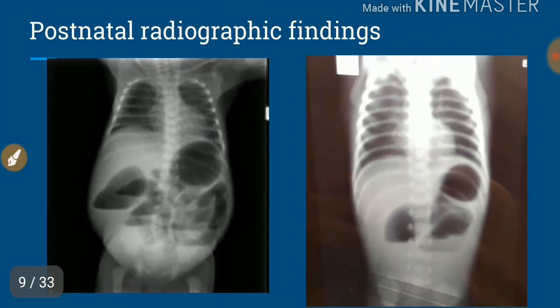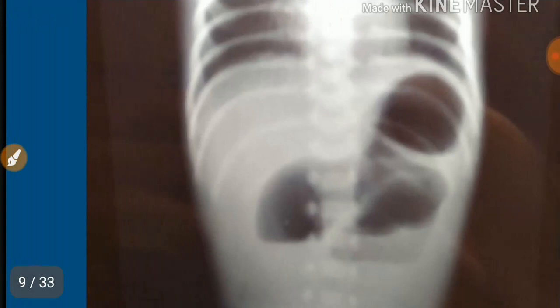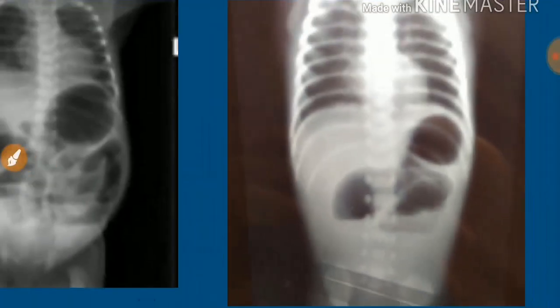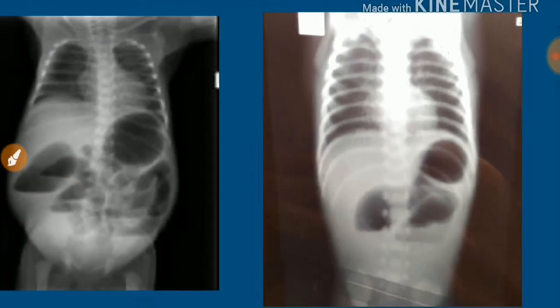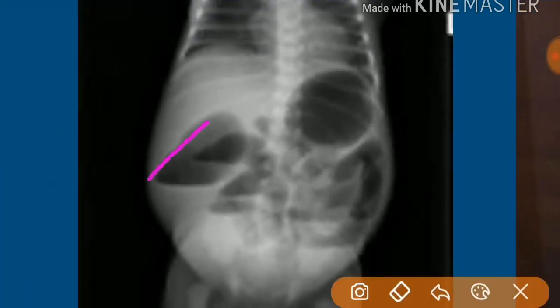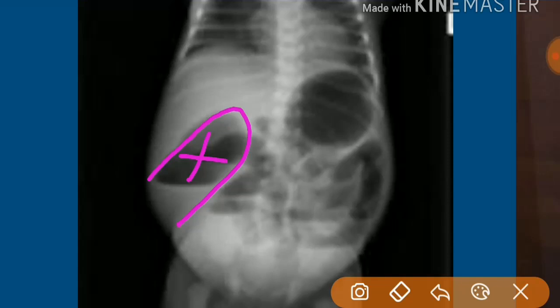Postnatal radiographic findings: we have seen the double bubble appearance; here we are seeing the triple bubble appearance. In jejunal atresia, there will be classically a triple bubble appearance, and we can also see a paucity of air shadows in the distal part of the bowel. In ileal atresia, we can see classically a thumb-sized loop, and a paucity of air shadows in the lower part of the abdomen.